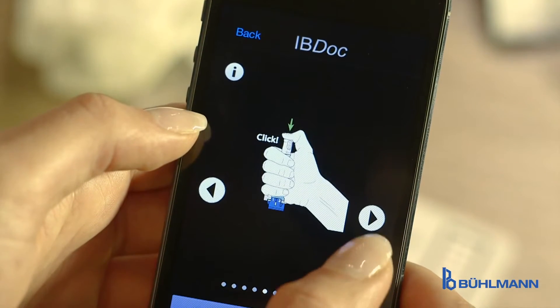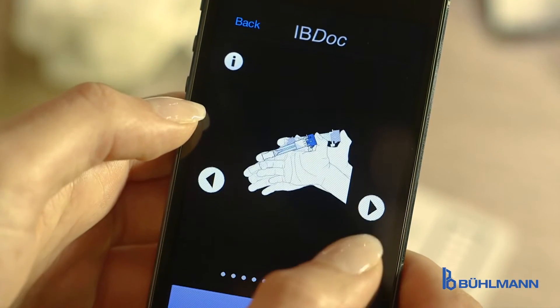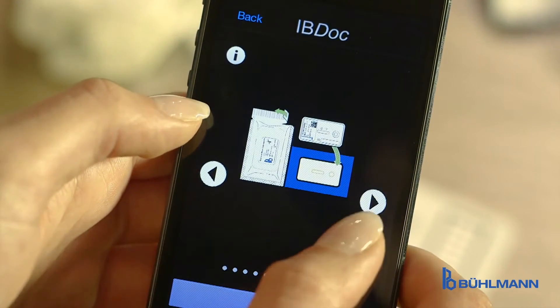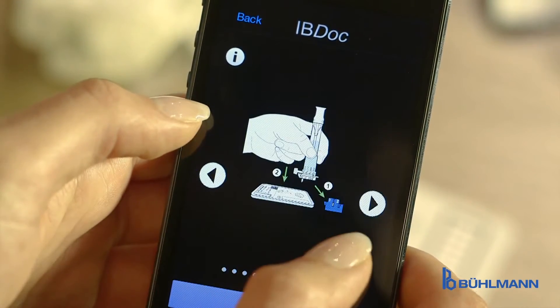The first step is the sample collection, extraction and Calprotectin test run.